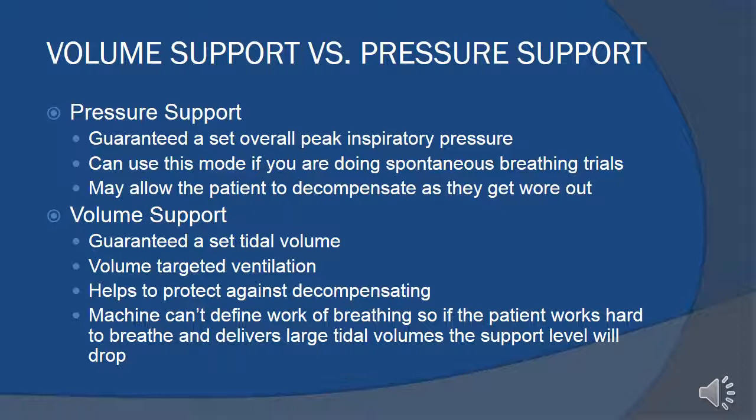What's a spontaneous breathing trial? Typically what happens is this is coordinated between nursing and respiratory. They'll usually lighten the sedation on the patient. At the same time, you put your patient in pressure support. You turn the pressure support completely to 0, so all they're getting is CPAP or PEEP, and we see how the patient does. All right? You can't do that in volume support.